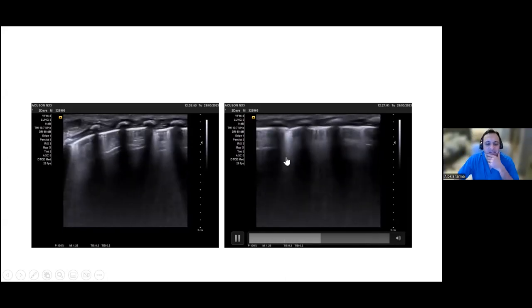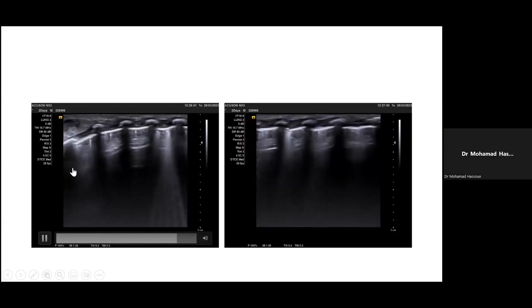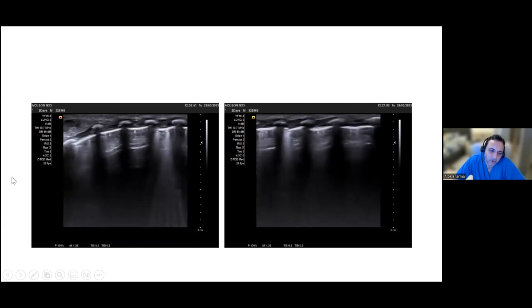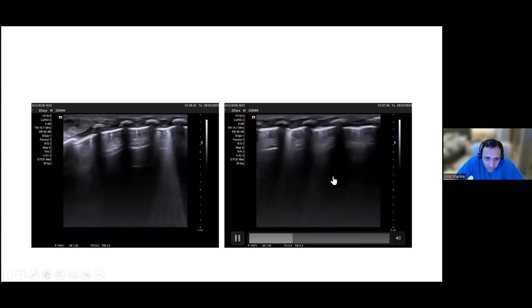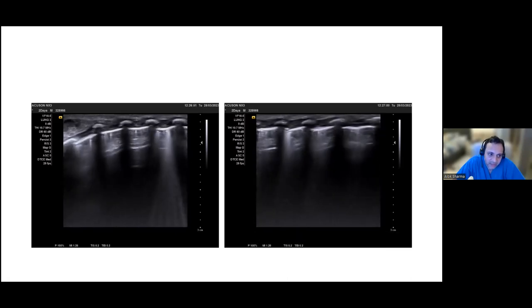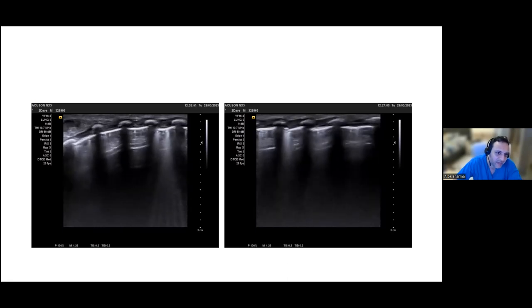So again, there are elements here of an overlap of both, because if you look at the image on the left, that's a double lung point for you. And just look at this on the left side: can we consider it as consolidation or just loss of contact? My gut feeling is it's artifact, because if you look at the pleura, it's completely regular and it doesn't take its origin from the pleura. So really what you should have is some element of pleural irregularity. If you look at the image on the right, the one where we were previously, that is a consolidation. But that deeper density that you see, there's something going on over there, whether you've got a little bit of an air bronchogram coming in and out, because there's an element of aeration, or whether that might represent a consolidation that you can't see because your alignment is at a different angle.